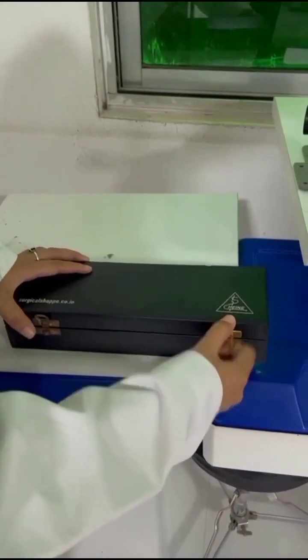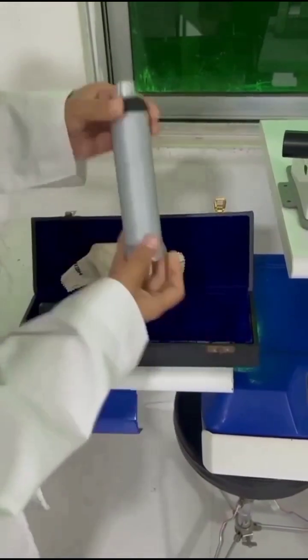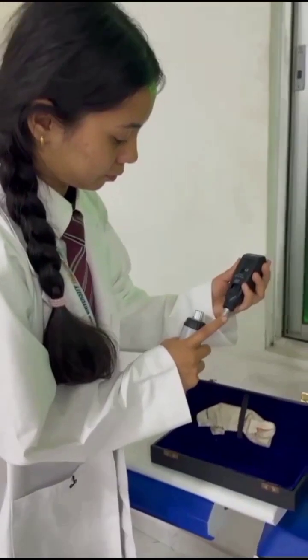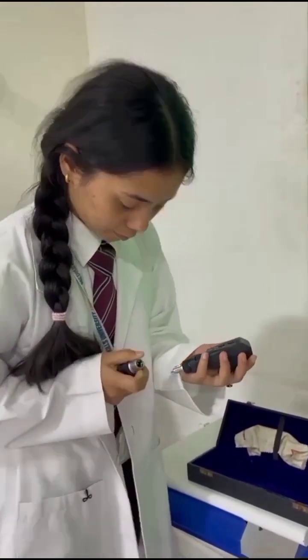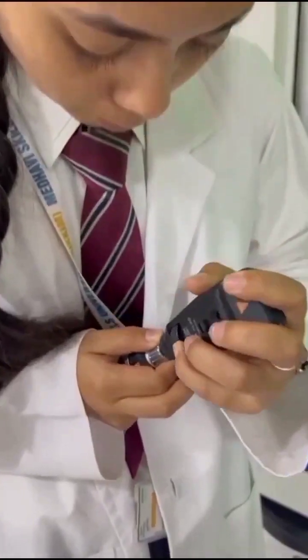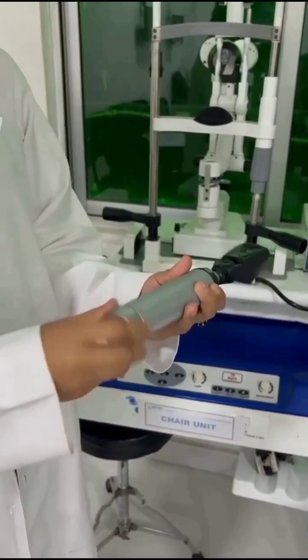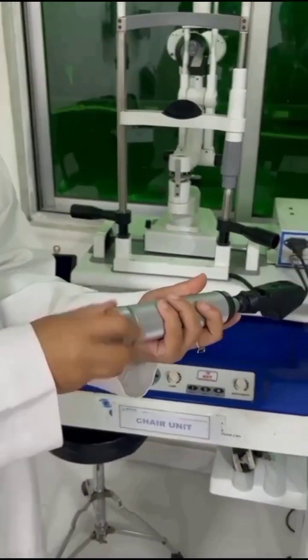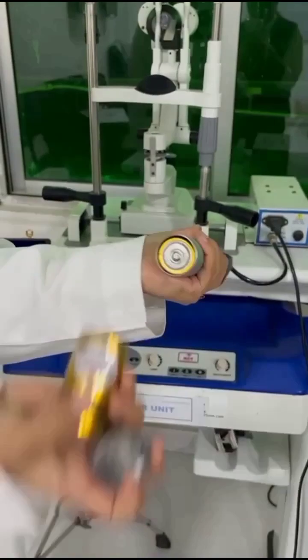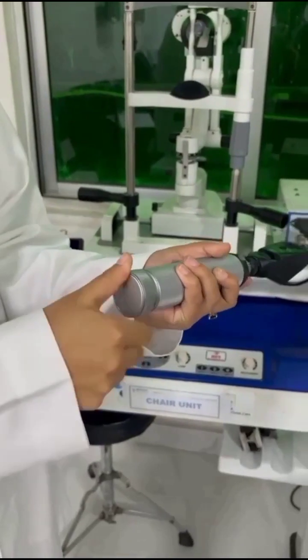This is the box of the retinoscope. This is called a silhouette. This is the retinoscope. There are two parts of the retinoscope. Now I am connecting these two pieces of the retinoscope, and now at the bottom we see a cap. If we open it, there is a hollow space where we can put our battery, and we cover it.